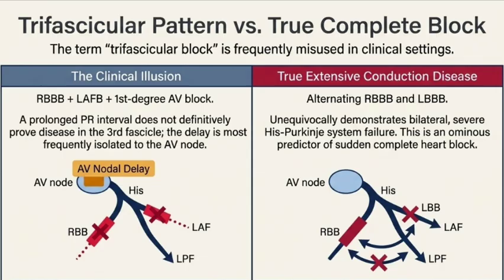Exactly. Clinicians look for ST elevation of more than 1 millimeter that moves in the same direction as the chaotic spike. We call that concordant elevation. Okay. But the most vital metric is looking for excessive discordant elevation. They use a very strict mathematical formula, an ST to S ratio of less than or equal to negative 0.25. If the baseline moves out of proportion to that specific ratio, the block is hiding a massive ischemic event. It is basically an incredible mathematical filter to find the real danger.